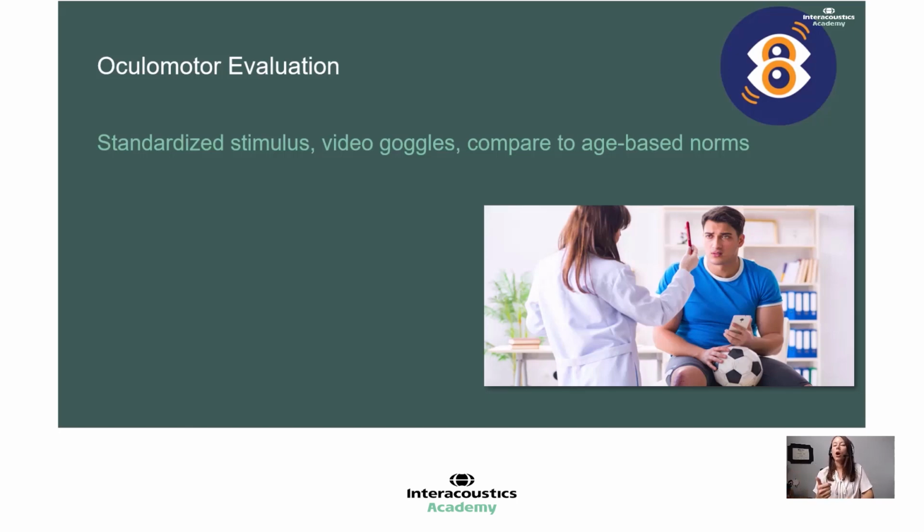So it's hard to tell how much change a patient has had if you can't ensure that your stimulus is exactly the same in each appointment that you have with them. So using video goggles to not only provide the standardized stimulus, but also to measure and record the exact changes in their eye movements can be very beneficial in this population.